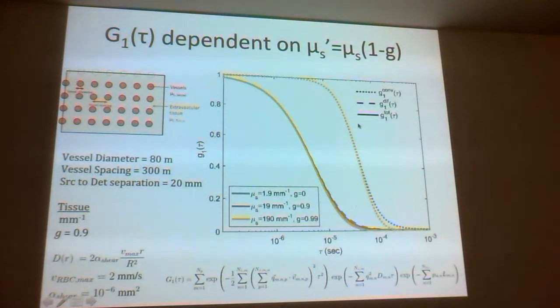I'm not sure if I got this right. If you said that when you do the fitting, you have to appeal to Brownian motion, would that have any impact on the OCT angiography method? So we look at speckle variance and so on. If you do a model with liquid, static, you have the Brownian motion. So you have to do the setting to get rid of the static scattering centers in a different way than if the flow is moving. So that is Brownian motion.